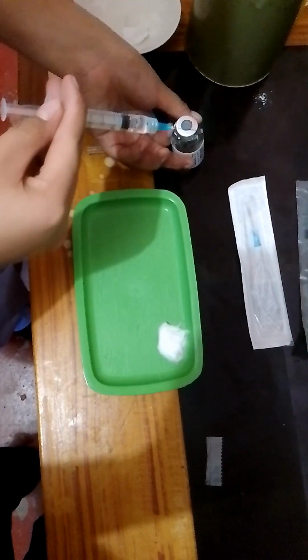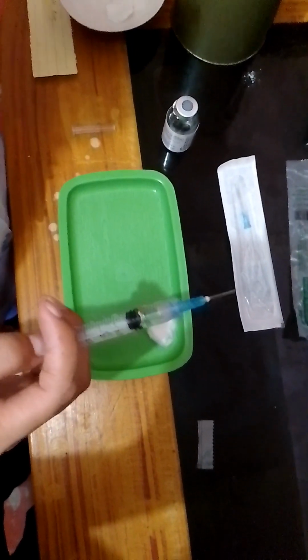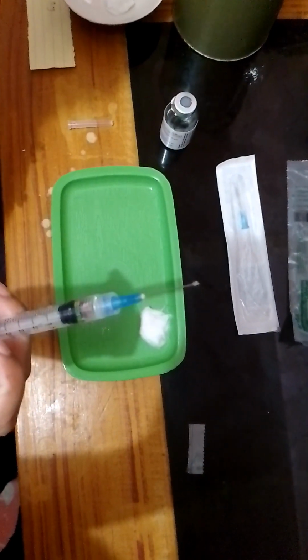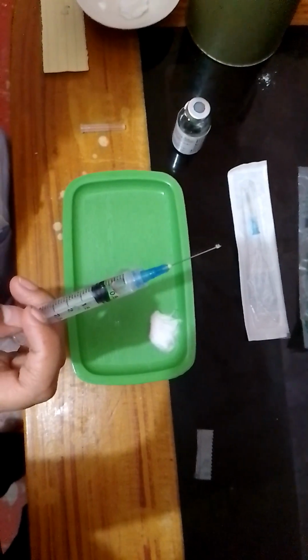And after that, we need to remove the aspirating needle and replace it with a gauge 23 needle that would be used in the actual administration of the intramuscular injection.